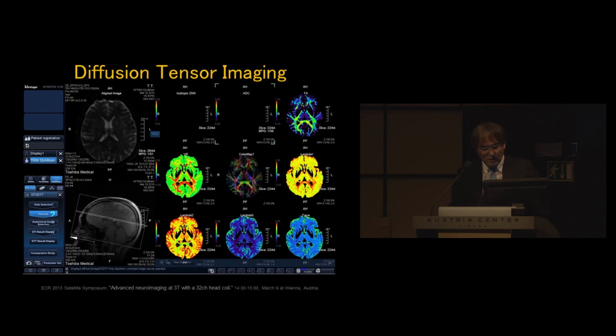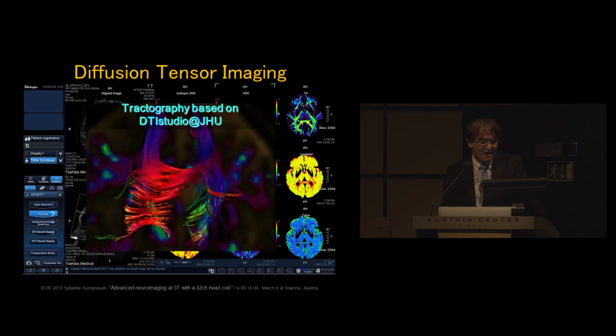And also you can go further. If you choose, you can do tractography. This program is based on DTI Studio, which was created by Johns Hopkins University. So the algorithm is basically the same.